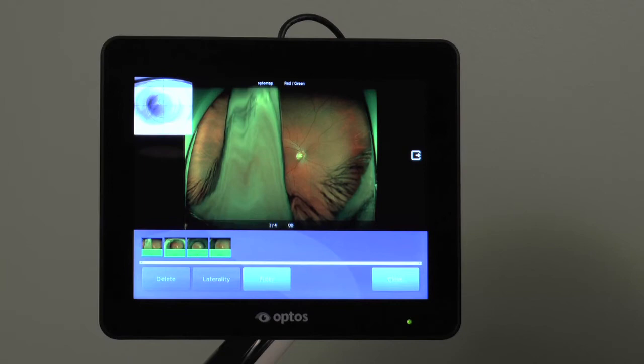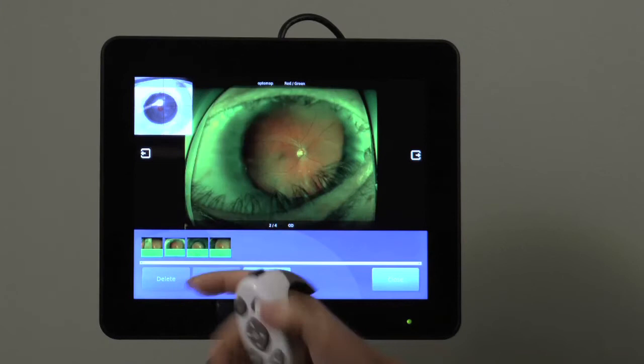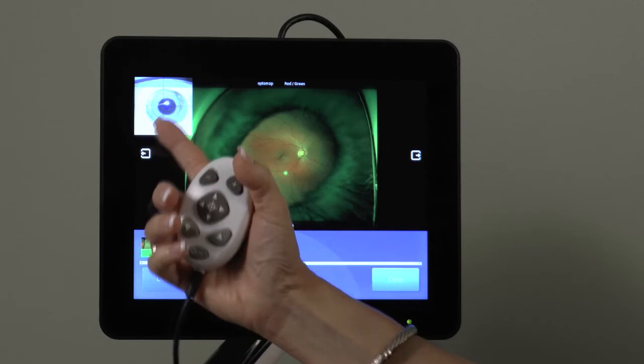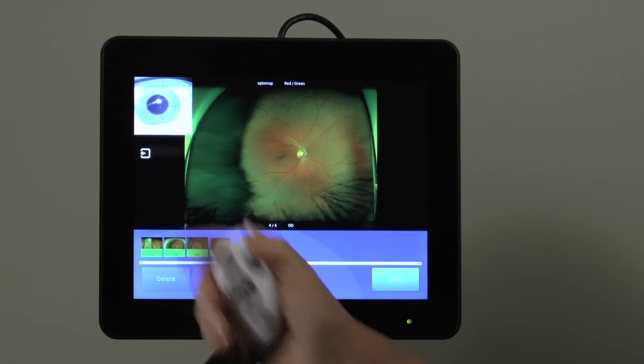When the patient is too close, as indicated by the red target, you will see a lot of lid and lash, as well as the iris. When too far out, as indicated by the blue target, you will see iris or shadow cast by the iris. And when off-center, or if the patient moves, there may be artifact in only one portion of the image.